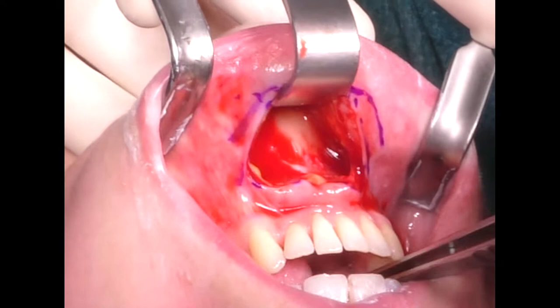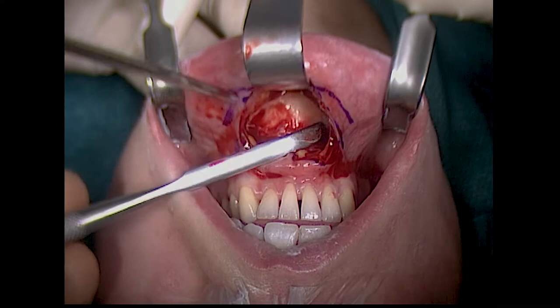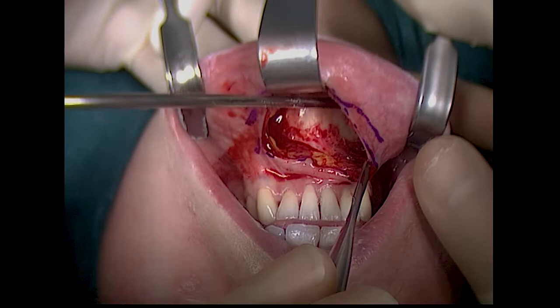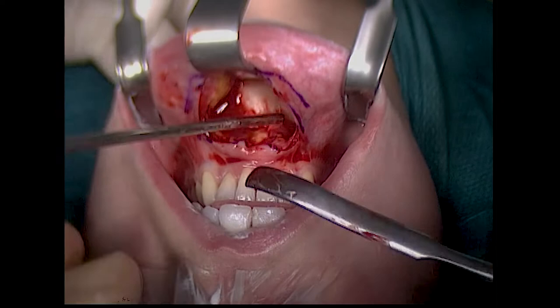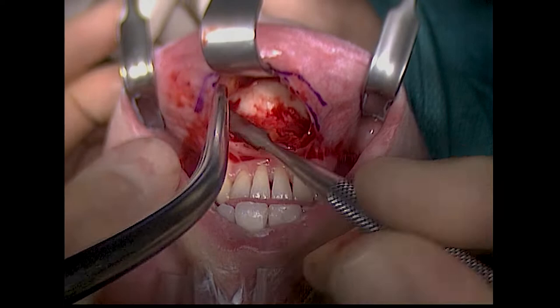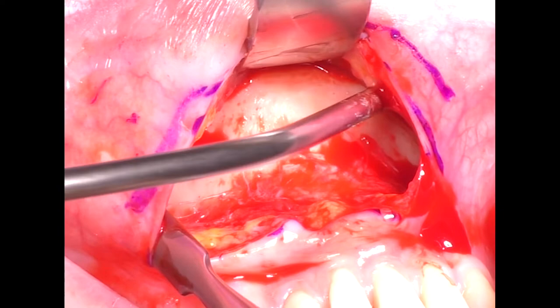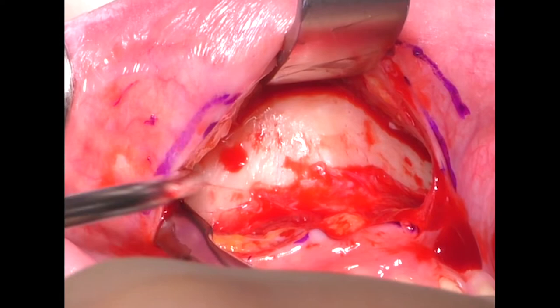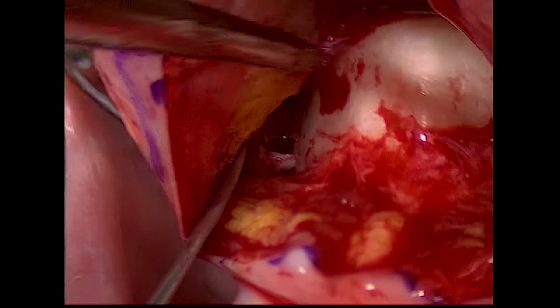A chin retractor. The periosteal scraper is tunneling there. I'm looking for the mental foramen — try to stay about 8 mm below it. Of course I have the radiographs, the CBCT, and the OPG at hand, and these are helpful to identify the position of the foramen. The mental nerve, of course, and the tunnel.